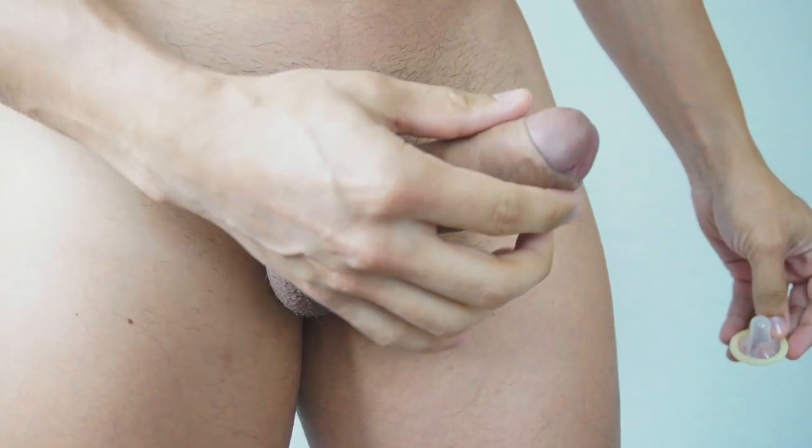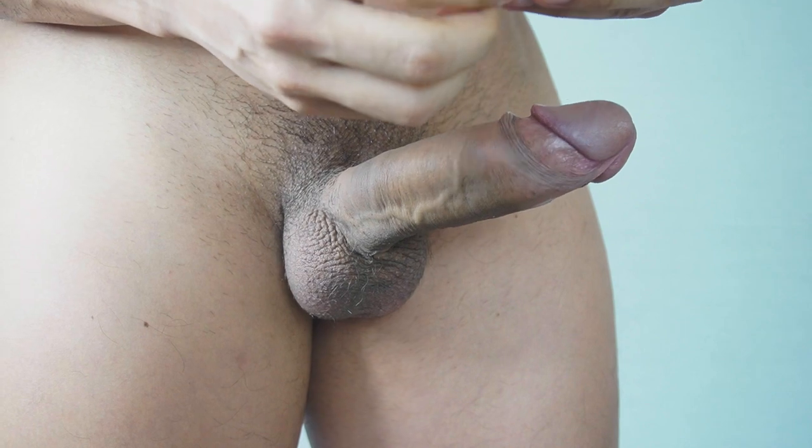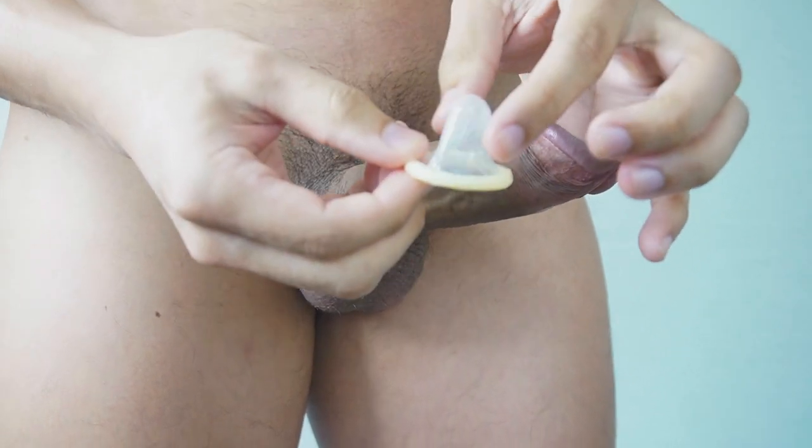With your penis fully erect, slightly pull back the foreskin and then place the base of the condom on the tip of your penis.